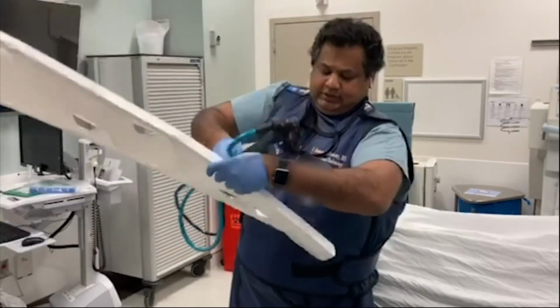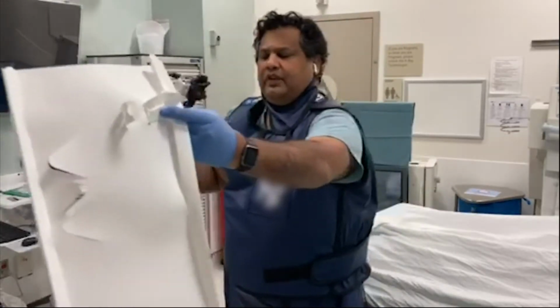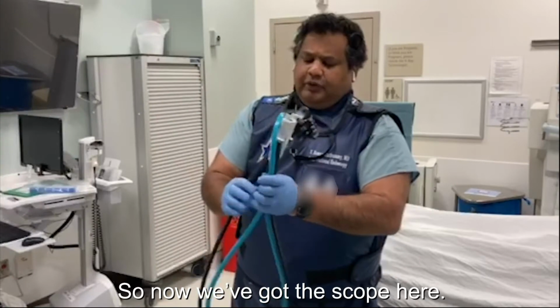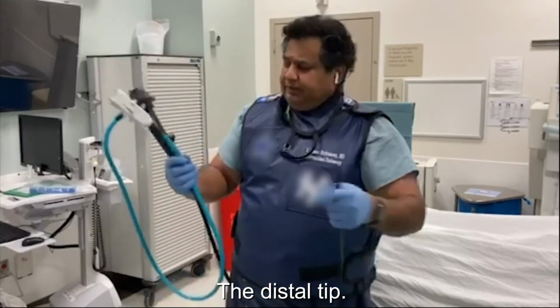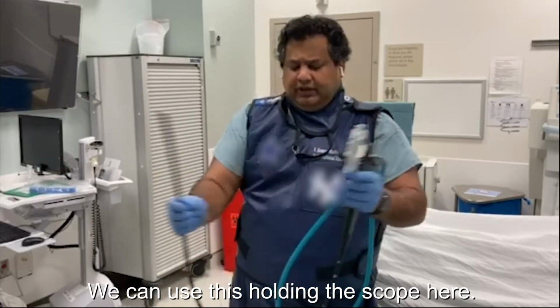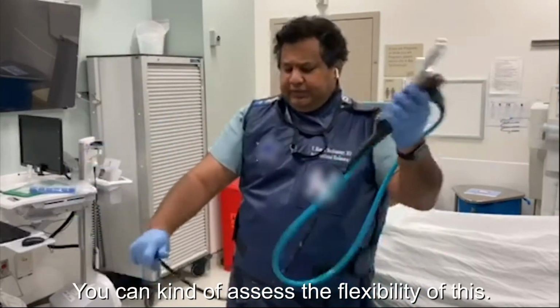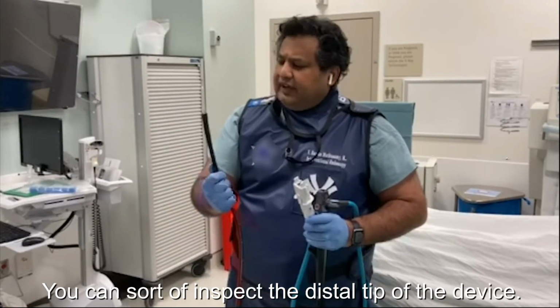A little connection here. We pull the scope out. We've got that out. So now we've got the scope here. Again, here's the connector port, the distal tip, and so we can use this holding the scope here. We can assess the flexibility of this and inspect the distal tip of the device.